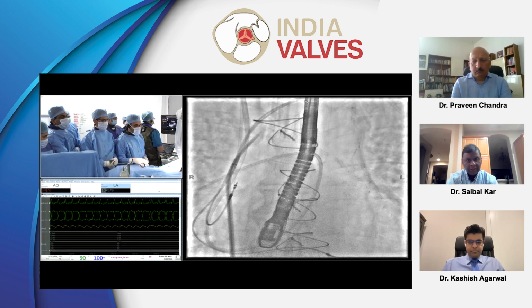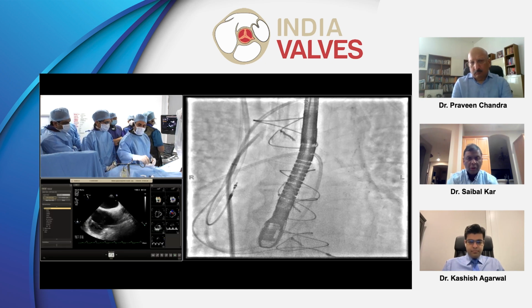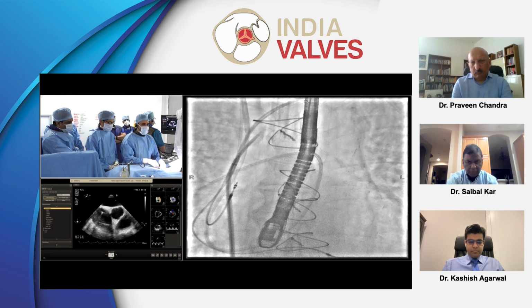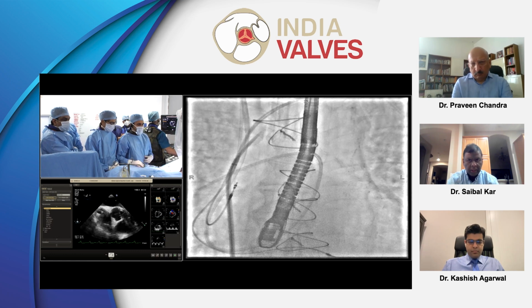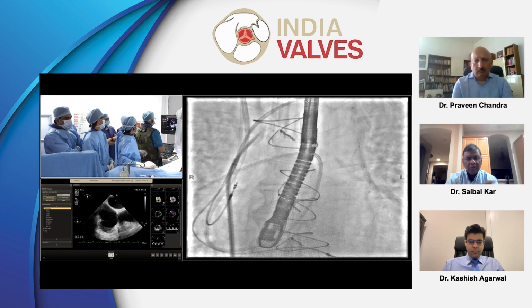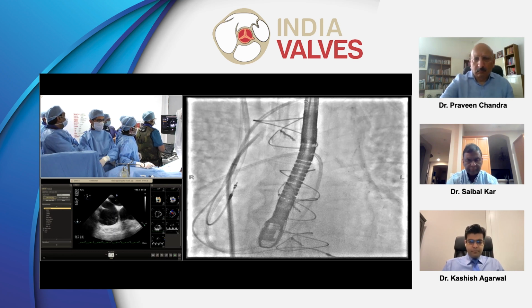Regarding the clip size, usually for DMRs, I tend to use the longer clips. I use XT or XTW. The only issue I have is the posterior leaflet length. The anterior leaflet is okay. If the posterior leaflet is greater than 1 centimeter, then I would definitely use an XT, and most likely with the valve area of 5.8, I would just use an XTW.